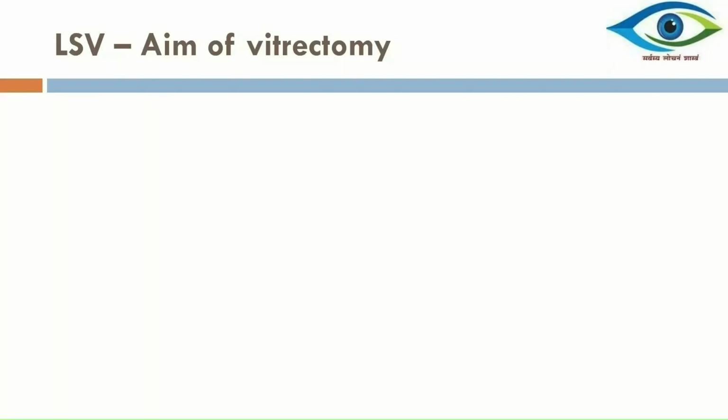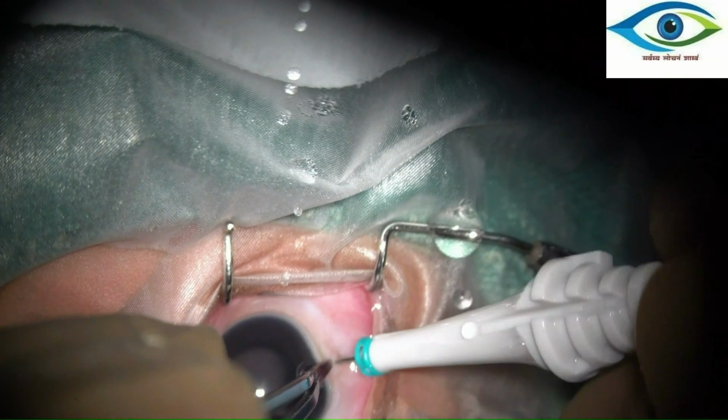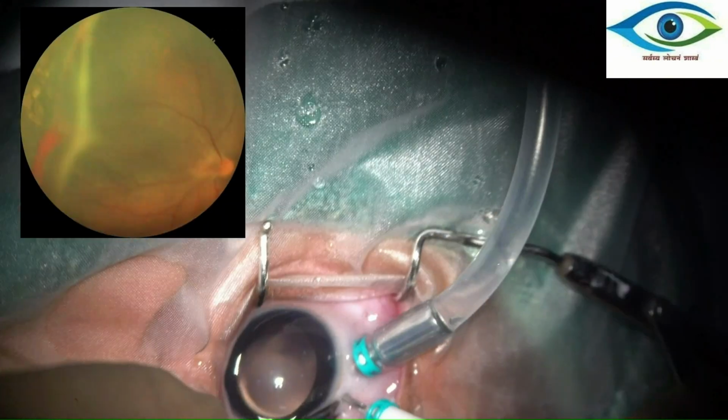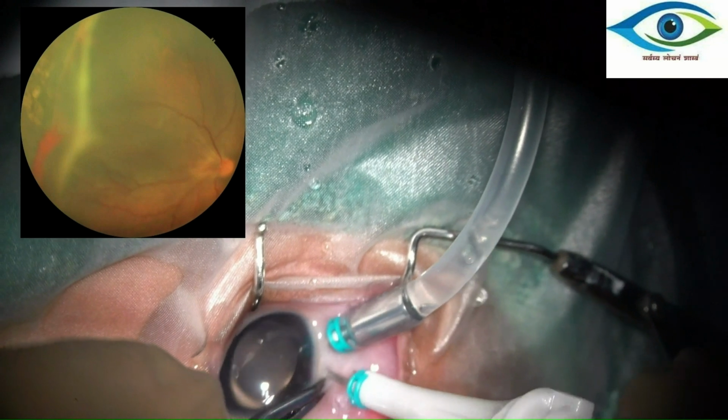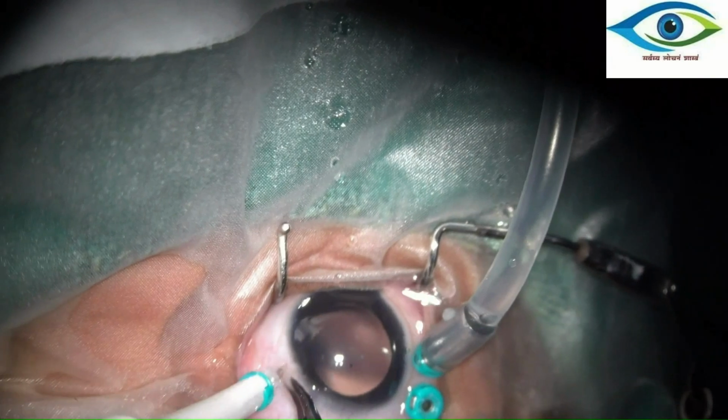The aim of vitrectomy in ROP is to identify all tractional bands and to dissect them properly. This is the video of lens-sparing vitrectomy performed for stage 4A ROP, in which progressive traction started threatening the macula despite adequate laser to the peripheral avascular retina. As the peripheral retina was not much anteriorly pulled up, a conventional 3-port approach was adopted.